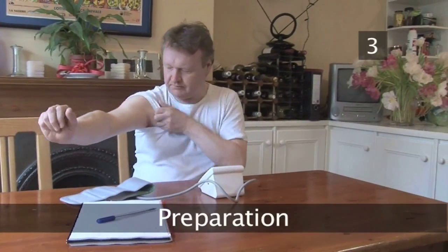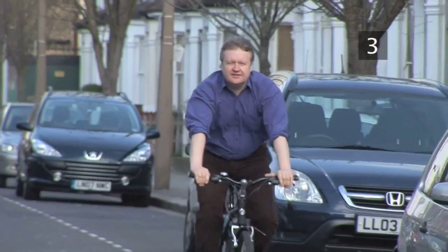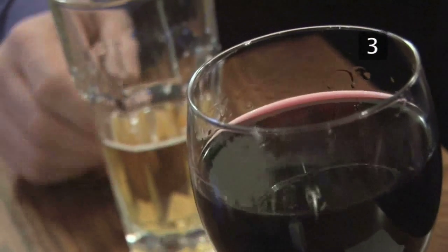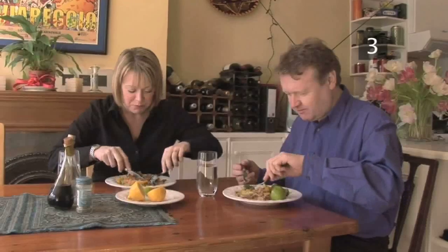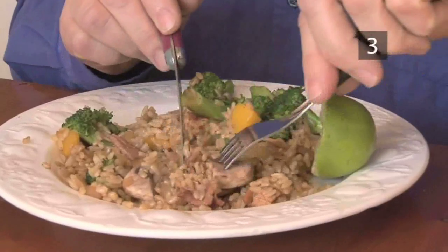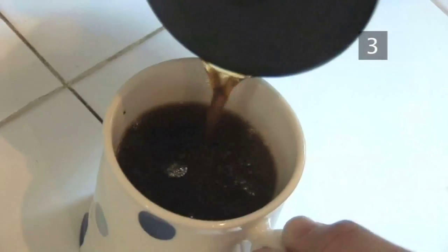Step 3: Preparation. Several factors can make your blood pressure rise temporarily: exercise, alcohol, illness, caffeine, tobacco, a full bladder, anxiety, excitement, and pain are just a few. When you take readings, make sure your bladder is empty and you have not just eaten a meal. You should also avoid taking measurements within 30 minutes of drinking caffeine or smoking.